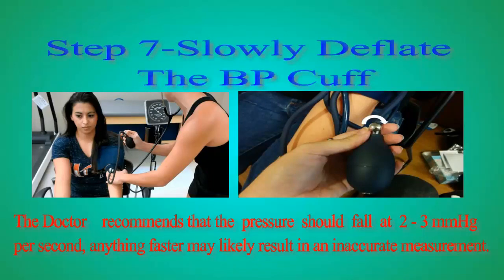Step 7: Slowly deflate the BP cuff. The Doctor recommends that the pressure should fall at 2 to 3 millimeters of mercury per second. Anything faster may likely result in an inaccurate measurement.